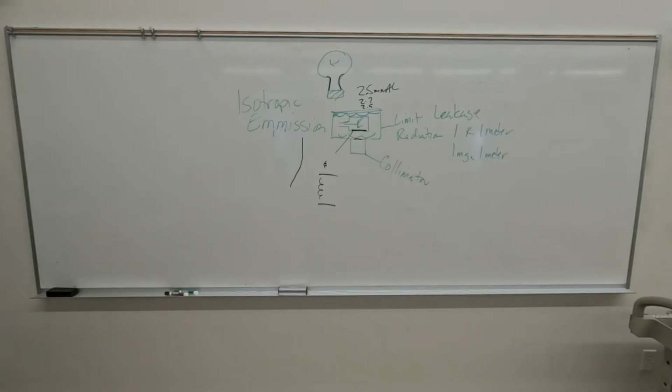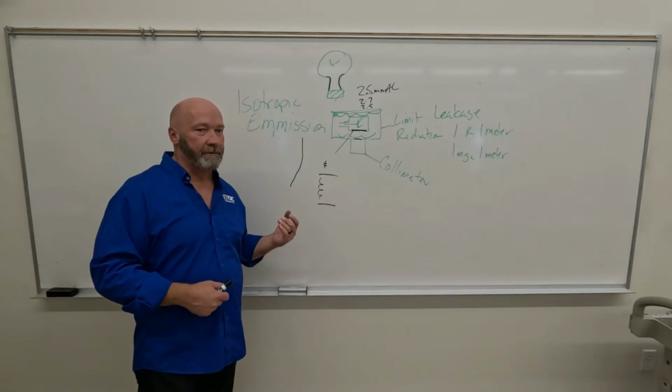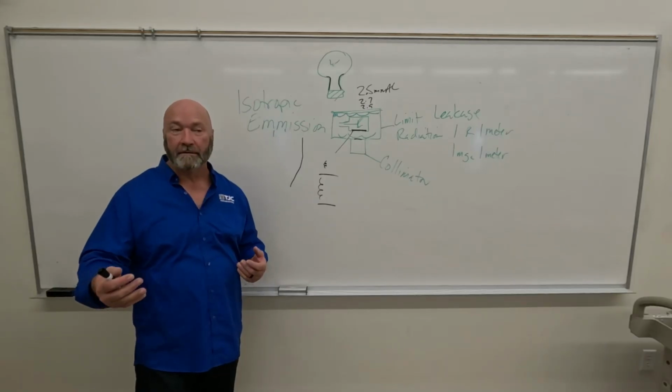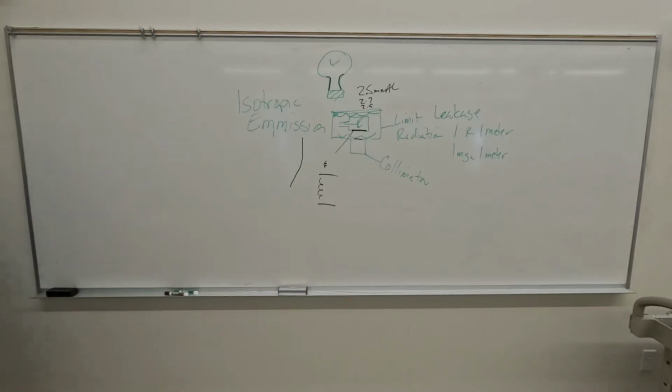Okay, so a couple of things. We talked about these in the last section, space charge effect and saturation current. Space charge effect is making sure that we only send the number of electrons across that we want to send across. It has a couple of different components. At high filament current, we can't send any more electrons across the tube.